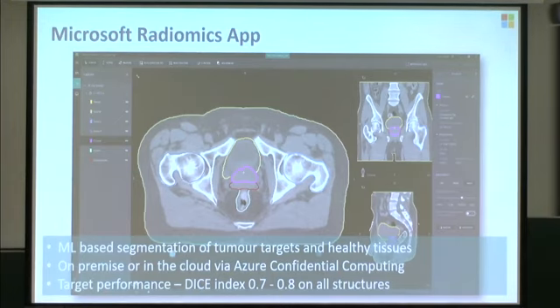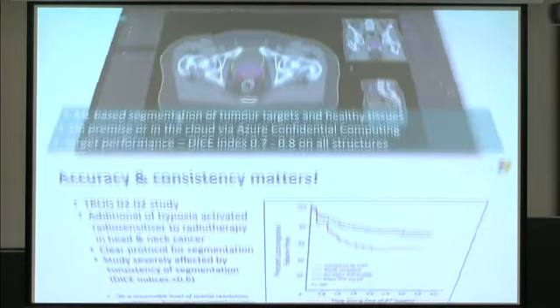But what's interesting is that our performance is actually good. We set targets when we were designing the ML, using dice coefficients for what we wanted to aim for, that were comparable with inter and intra-observer variation. So if you like a Turing test, we wanted our segmentations to be indistinguishable from the human operators. And that's what we've been able to achieve, but it's taken a lot of work. We have not been able to use the raw data that came from clinics to do this. We have had to resegment to a grade that is suitable for machine learning.